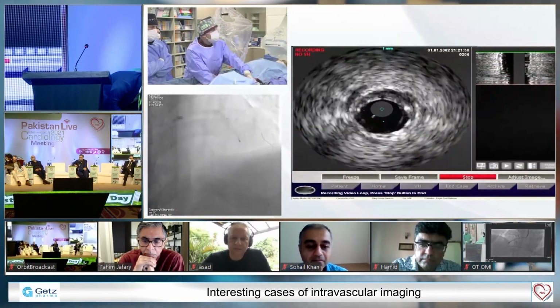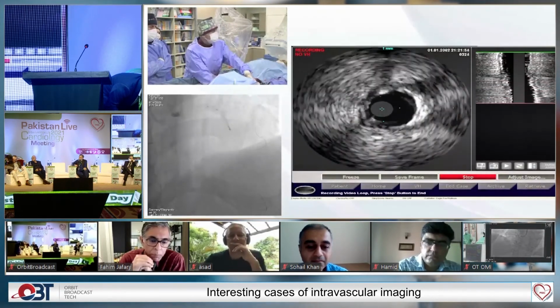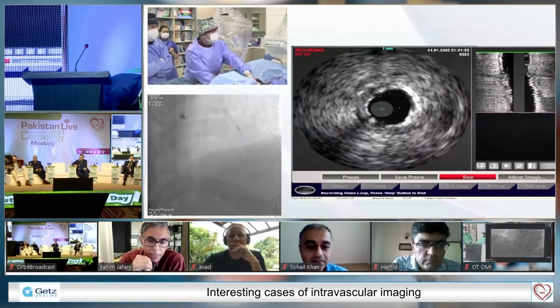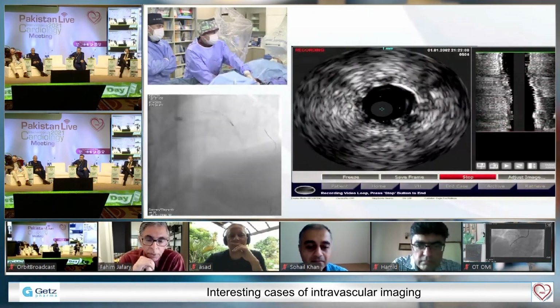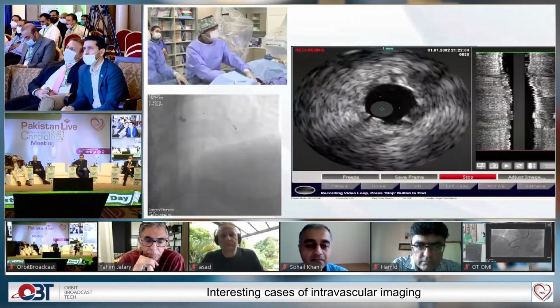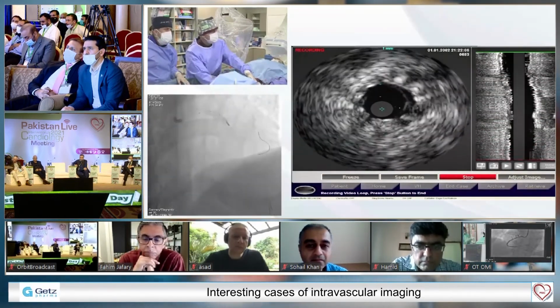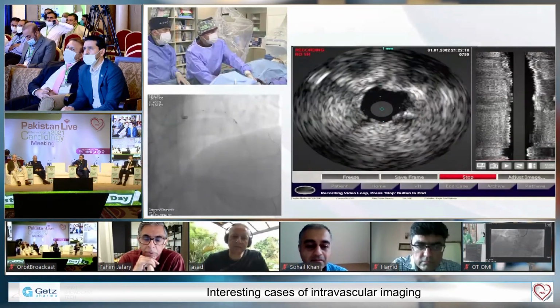So I should definitely do post-dilatation, my friend. Yeah. I think that's an important point, that all stents should be post-dilated. That sometimes simple fact is conveniently ignored by a lot of operators. Especially with long balloons, we have to do it. It's mandatory. I think that's where IVUS guidance is very important immediately after stent insertion.